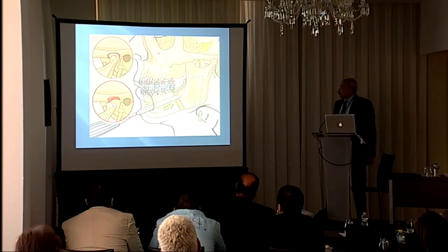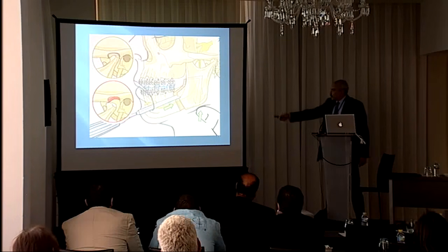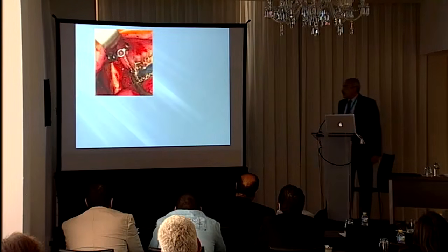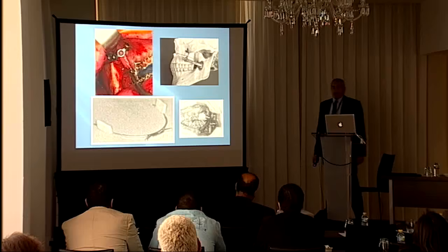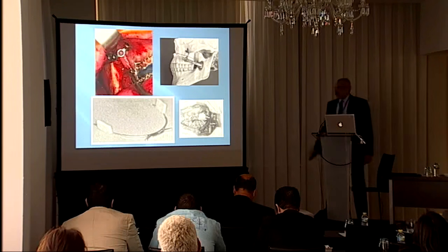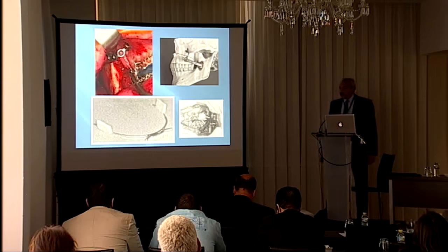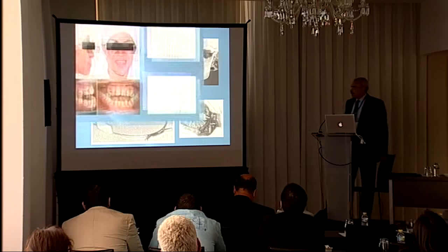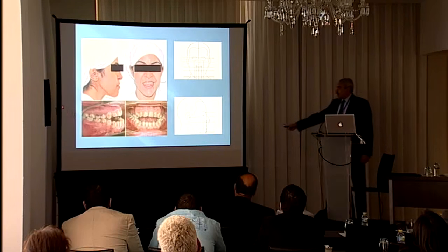And people try to do, we do that manually here. We push the segments and position them. And along the years, many what we call condylar repositioning or condylar positioning devices were introduced with actually no more value than the manual repositioning, so most of us were not using them. Now we're doing that computer guided.